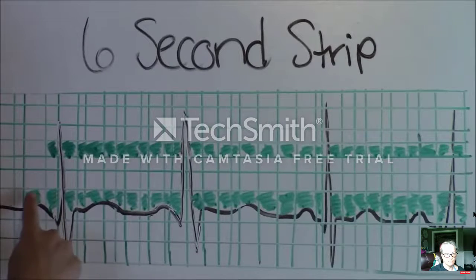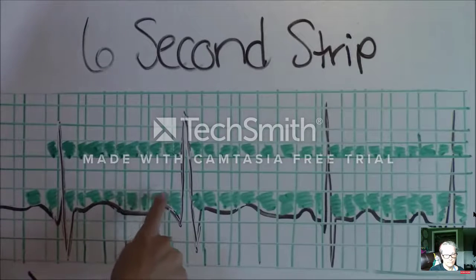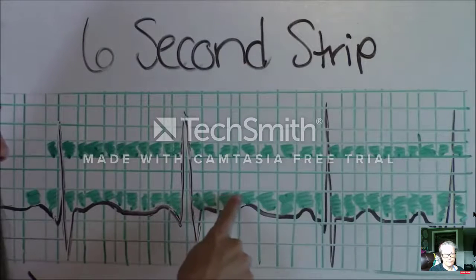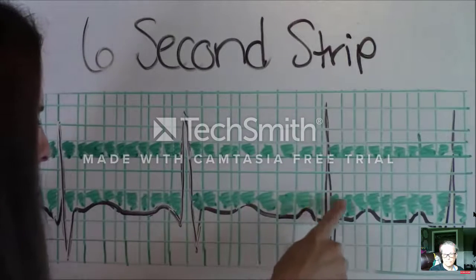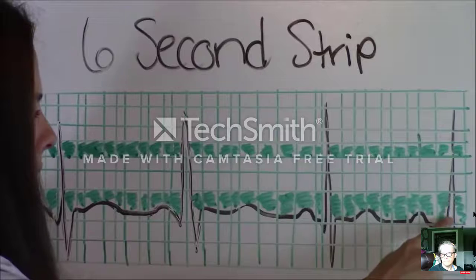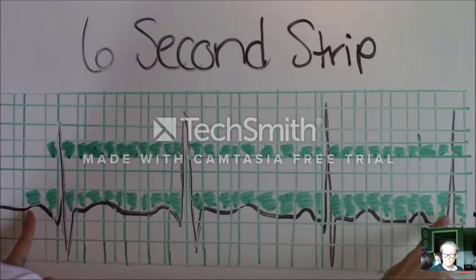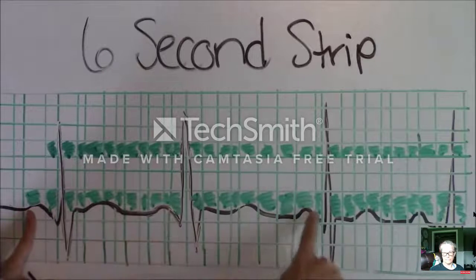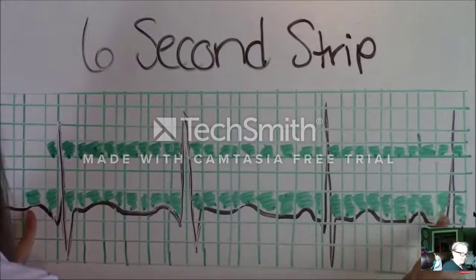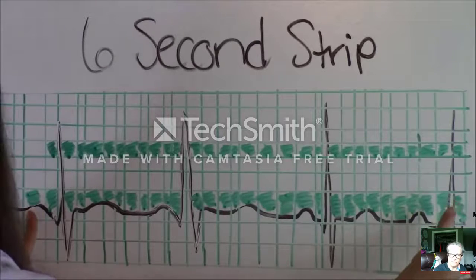So let's start counting. 1, 2, 3, 4, 5, 6, 7, 8, 9, 10, 11, 12, 13, 14, 15, 16, 17, 18, 19, 20, 21, 22, 23, 24, 25, 26, 27, 28, 29, 30. Right here is where we'll stop. We're measuring from here to here. How many P waves do we have in between? We have 1, 2, 3, 4. You take that number and multiply it by 10. 4 times 10 is 40. So we have an atrial rate of 40, which is slow. It's sinus bradycardia because the normal atrial rate is 60 to 100.